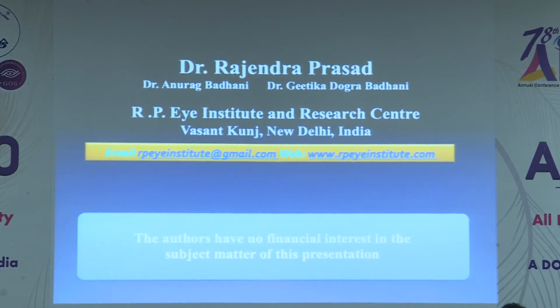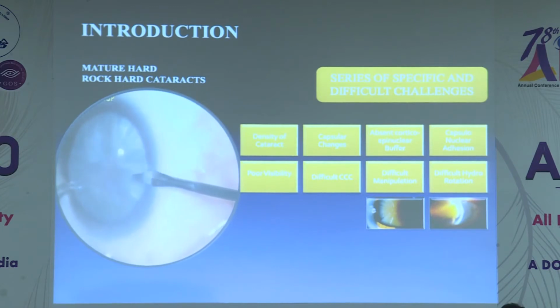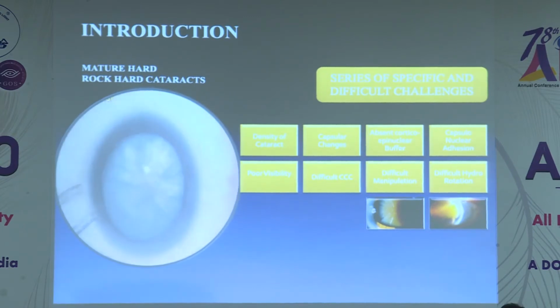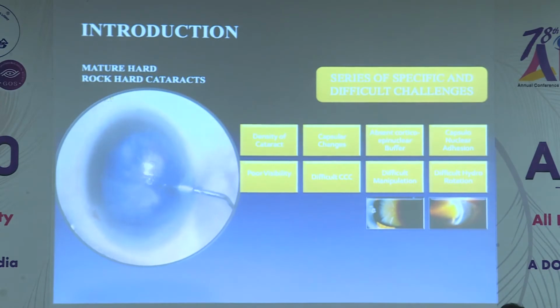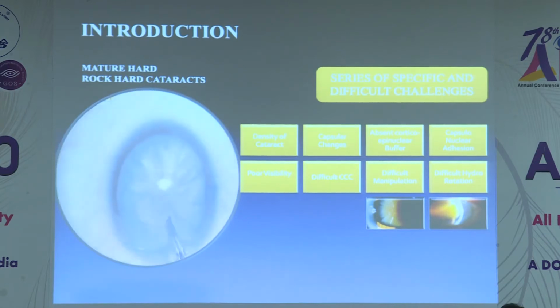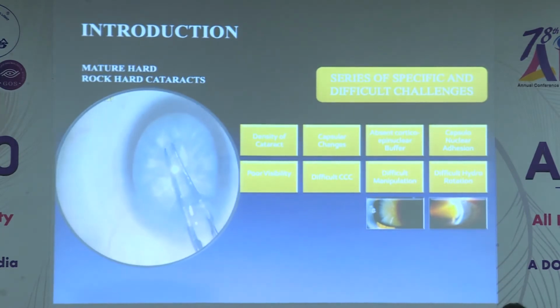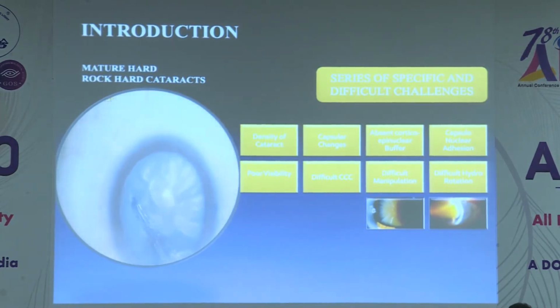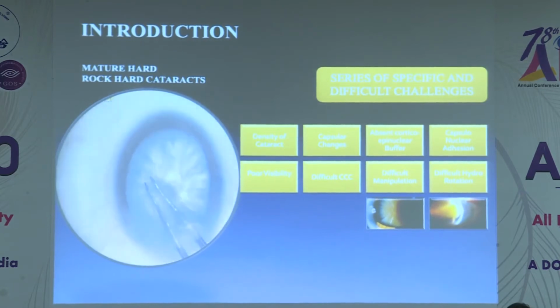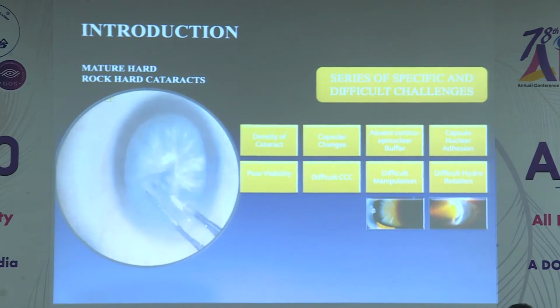It's marketed by Epsilon, and they have patented this chopper also. You have seen that hard cataracts give us many challenges during surgery, and these challenges are primarily because of the density of the nucleus, the capsular changes, the absence of cortico and epinuclear buffering material, and many times there is an adhesion of the capsule with the nucleus.